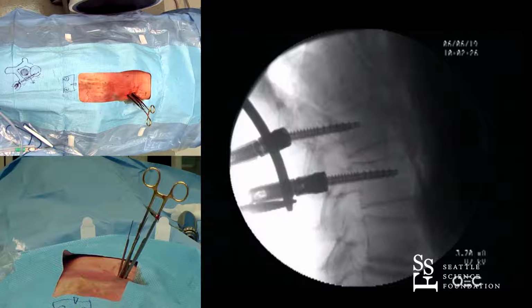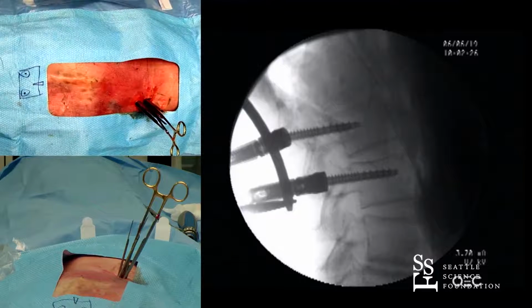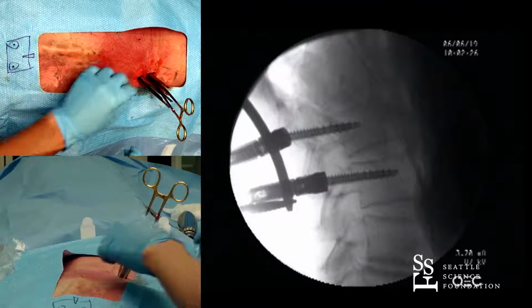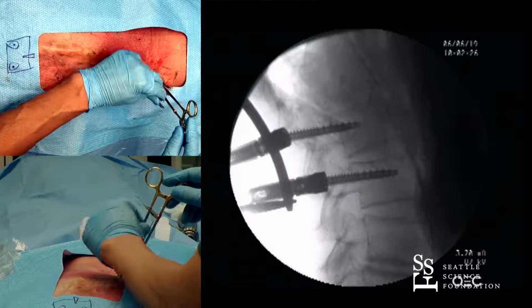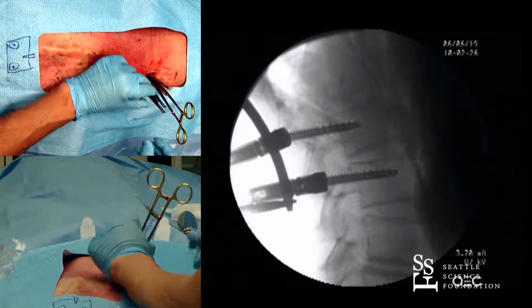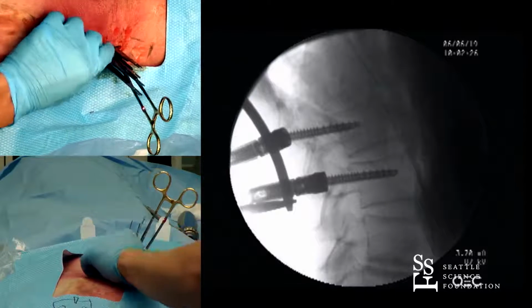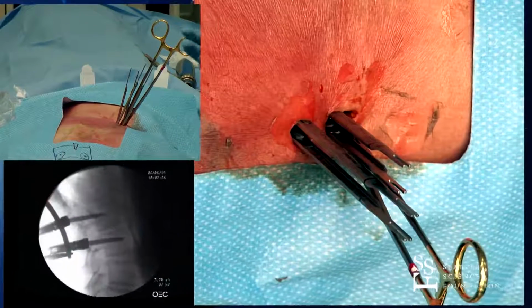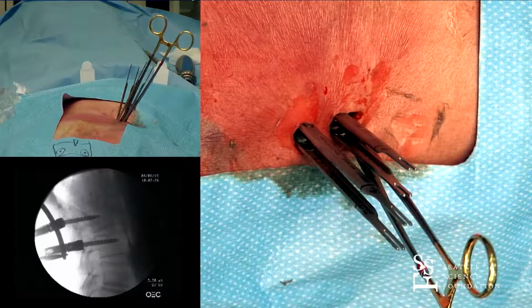Okay. So that's kind of what we call pedicle screw fixation, all right? And at the end, what we would do is that once we would lock the screws into place, you close them together? How do you take these things off? They just break off. Oh, okay, so these tabs would then break off, and then all you'd be left with is these two little poke holes, okay, which you would have to stitch up. Okay, and we don't leave these things in, all right?